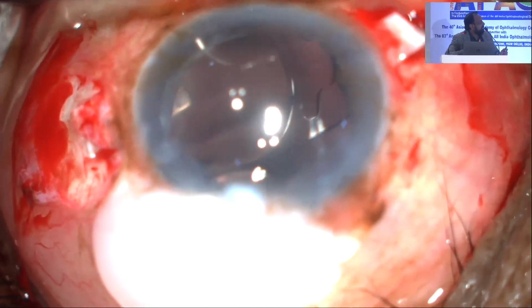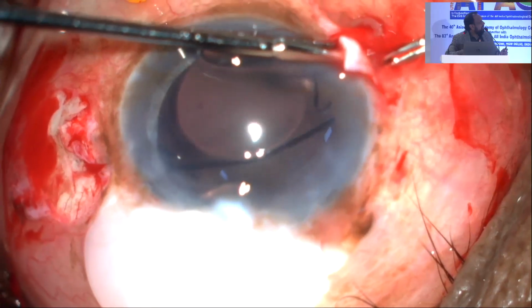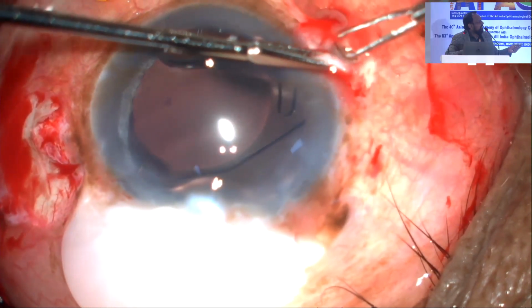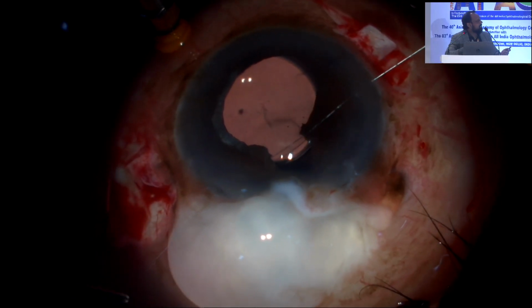As you can see, the other side is exchanged and then brought out. At the sclerostomy, there is going to be a slight tug. That is because of the instrument diameter. So what I suggest is you don't actually whack it out, because that can release the hole. Just wait at the sclerostomy end and give a constant pull, and you can actually see it slipping out rather than just trying to pull it out.